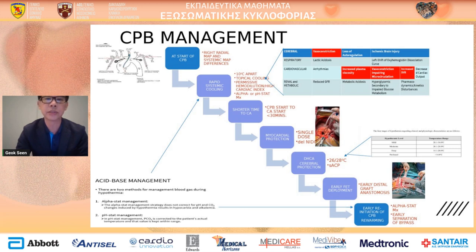In the early phase of starting bypass, the communication is very intensive, so make sure the patient doesn't suffer underperfusion. If they say it's so high, it means the vessel loop has to be tightened further downstream of the Unigraft anastomosis, so that you can divert more flow to the systemic circulation and get a better perfusion, right?